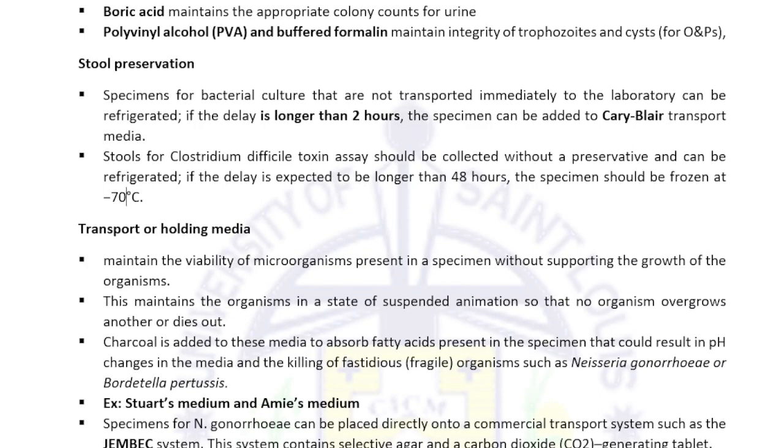Transport or holding media. So, for example, Cary Blair transport media. It maintains the viability of microorganisms present in the specimen without supporting the growth of organisms. It means that it keeps the bacteria, if in case bacteria is present, alive without nurturing it, without making it multiply. That's what it means. Okay? So, it maintains viability without supporting growth. This maintains the organisms in a state of suspended animation so that no organism overgrows another or dies out. Why? Because what happens if it dies out? We can no longer grow it. We can't multiply it in the lab. If that happens, that leads to false diagnosis.